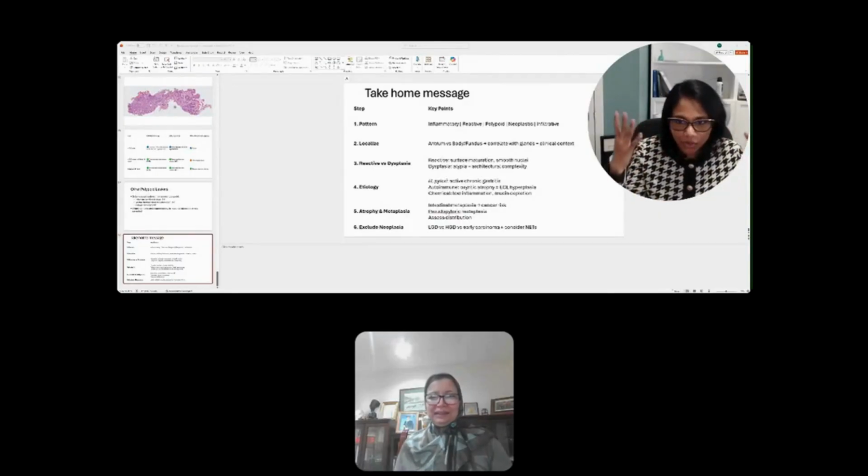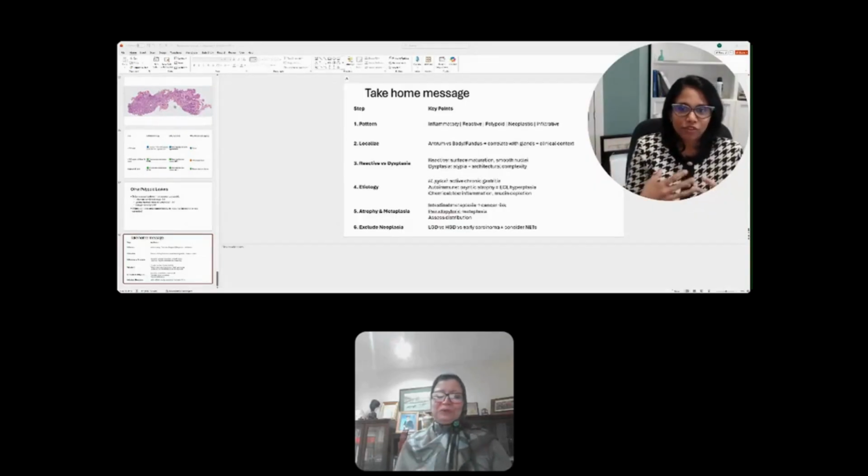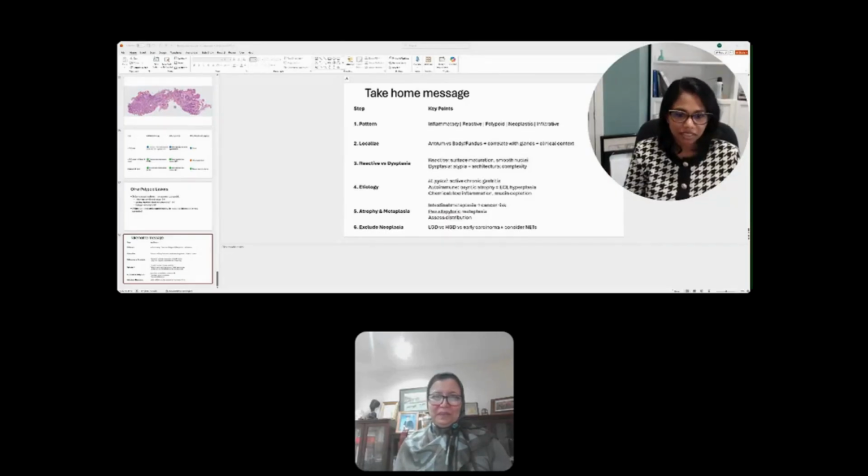So it gets your index of suspicion much higher and gives a lower threshold. Paradoxically, the more senior you get, the more defensive you are in your reporting. But you're right, it's also picking up the subtleties and making sure you exclude the rare, subtle presence of organisms.